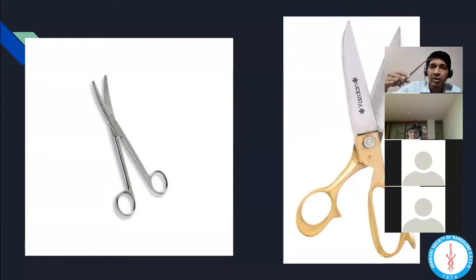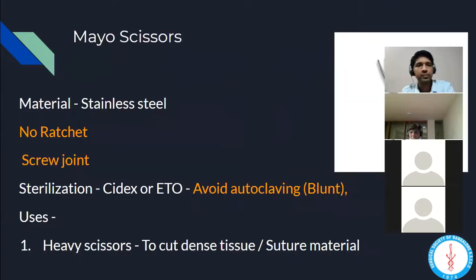So in surgery, whenever you're using a curved scissor, it's because it needs good visualization. Cutting is an irreversible step, so think 10 times before you cut anything. You need to see what you're cutting, and a surgeon cuts with the tip of his scissor, whereas a tailor cuts from somewhere deep in. For him, he just puts the scissor and in one right whack all the way through he'll go. But a surgeon can't do that. He has to go bit by bit, cutting with only the tip.